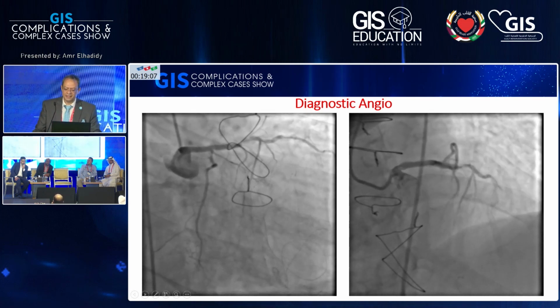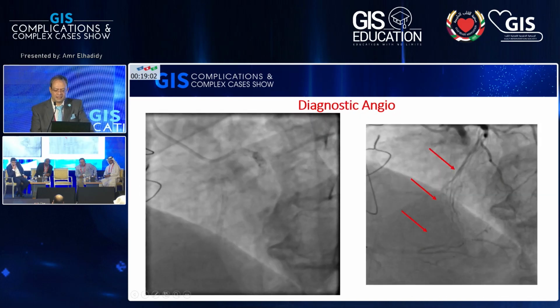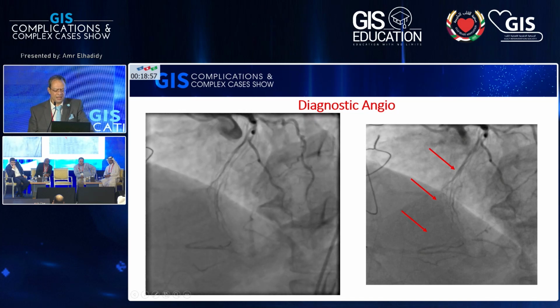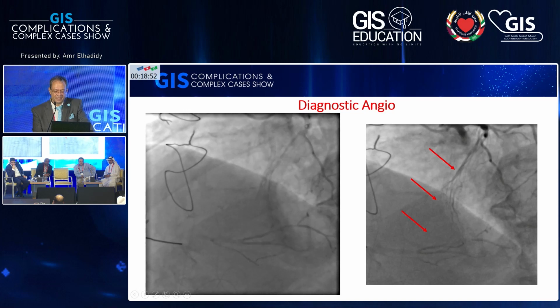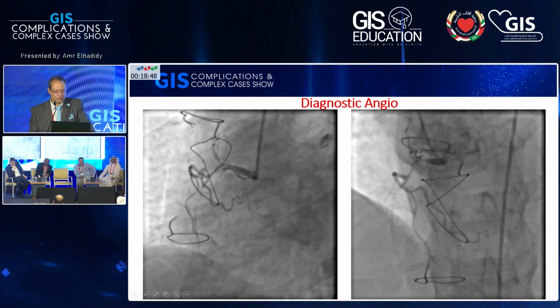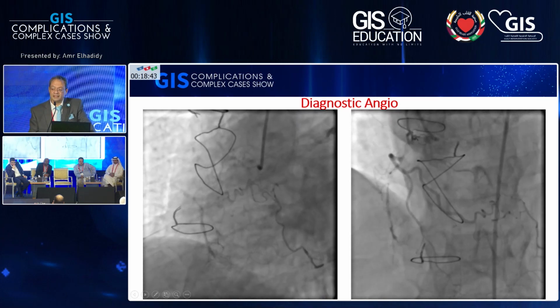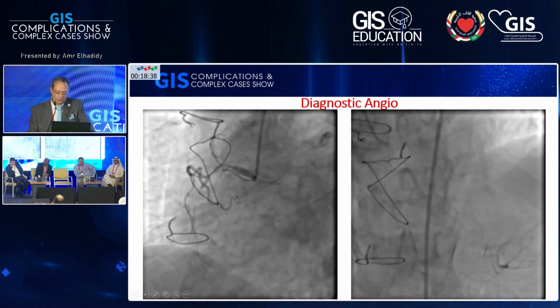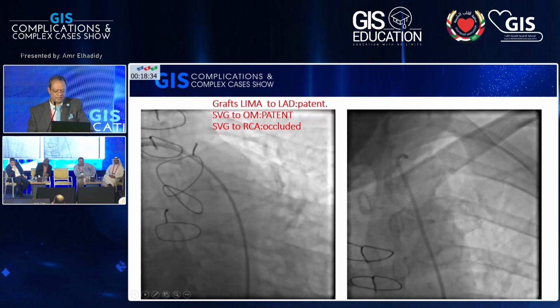As you see, there is an occluded LAD, and there is filling of the distal arteries through septal collaterals, as you see from this LAD to the distal RCA. Definitely, the RCA has a long diseased segment and is calcified. And these are very good septal connections. It shows how the RCA is diffusely diseased till nearly the mid segment, with good filling distally through the collaterals from the left system.